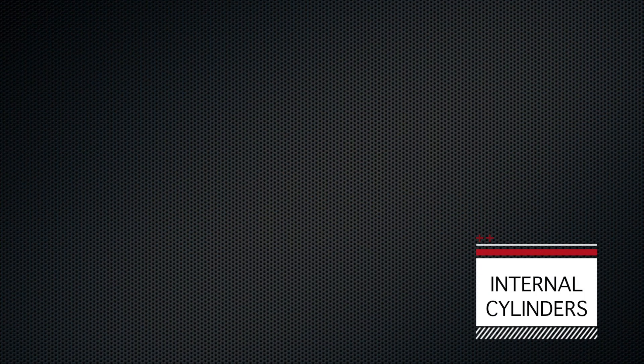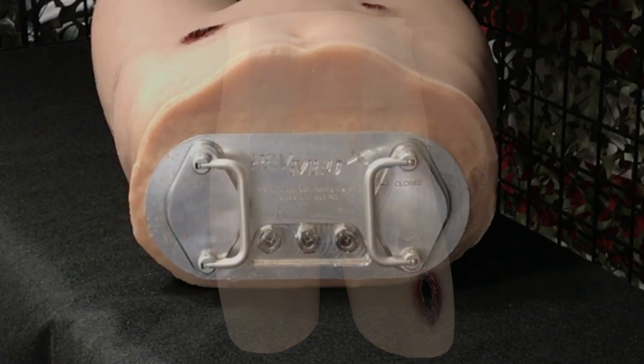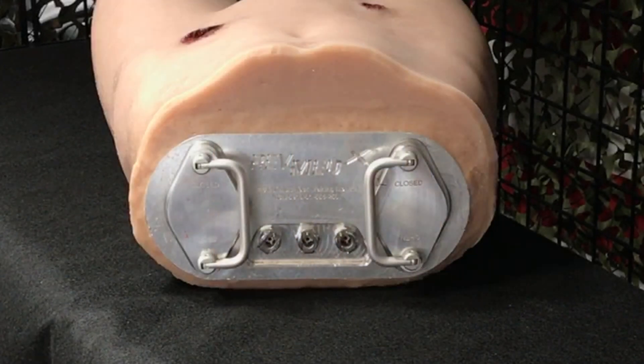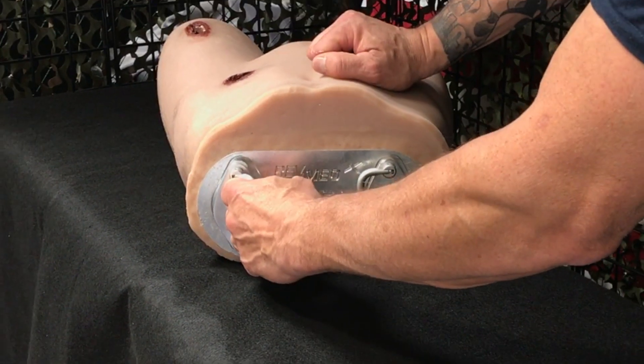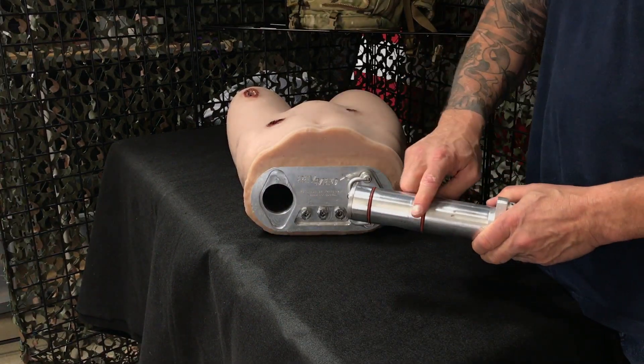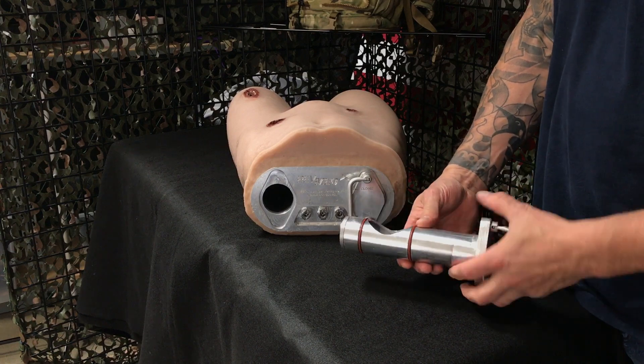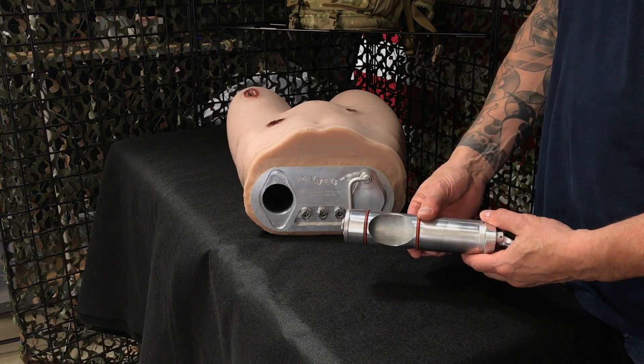The mannequin's internal cylinder system allows you to collect and remove excess sponges that you inject into the left or right junctional wound. These are accessed by the handles on the top of the mannequin. The cylinders have an opening on one side. When in the closed position, the cylinder seals the bottom of the wound. When turned 180 degrees, it allows the sponges to drop into the cylinder for easy removal.